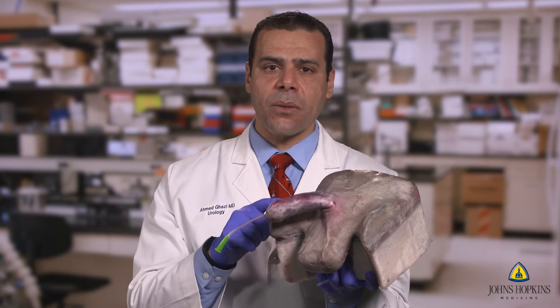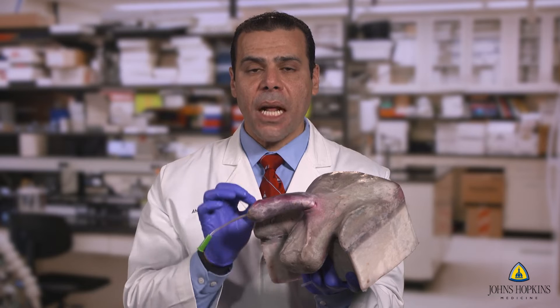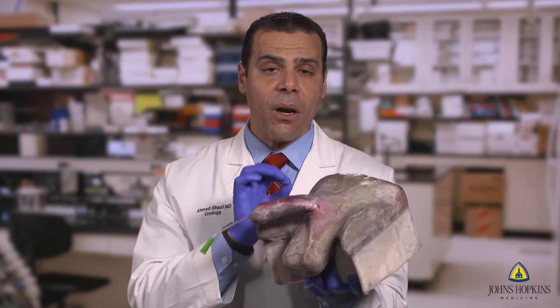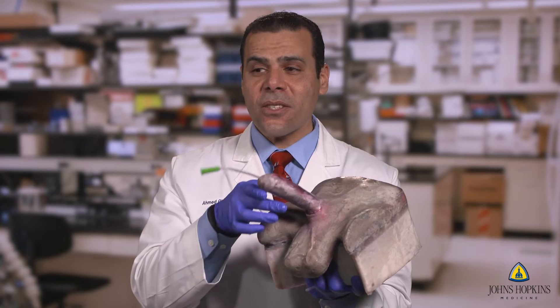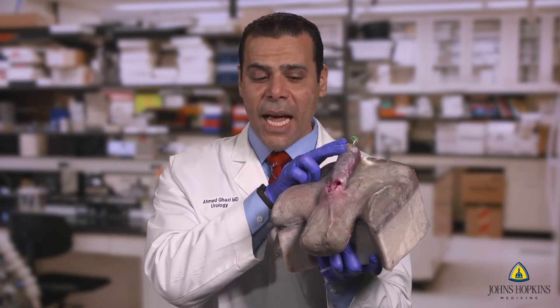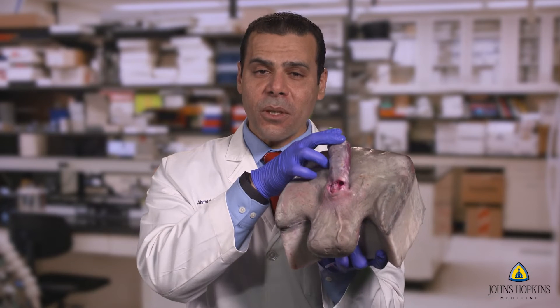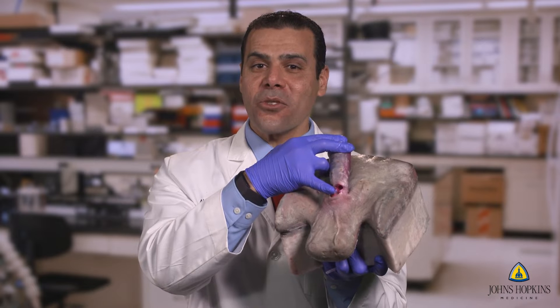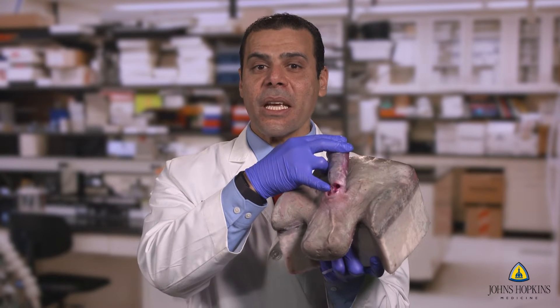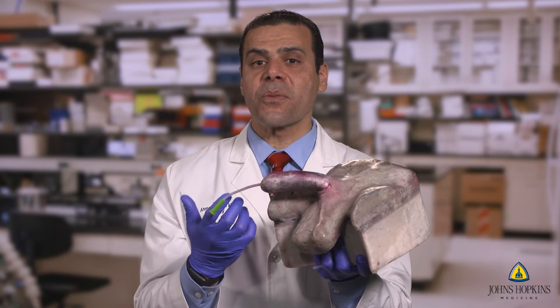This is a truly unique model that enables you to do a skin-to-skin penile prosthesis implant, regardless of the type of prosthesis that you place inside. Interestingly, this is one that one of our trainees actually practiced on, and you can see the openings in the corpora, but if you look closely, you can also see the urethra showing, which means they got a urethral injury. They are able to look at errors and understand why these errors occurred.